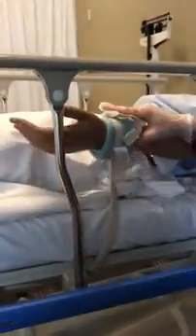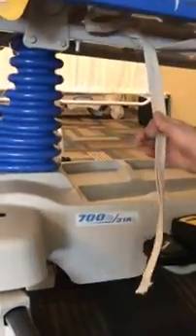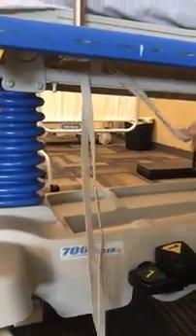Okay, and then I'm just going to pull her arm up just to show it's not coming undone. It's tight enough. So this knot is really cool because I would just pull it like that to undo it really fast if we needed to do something.